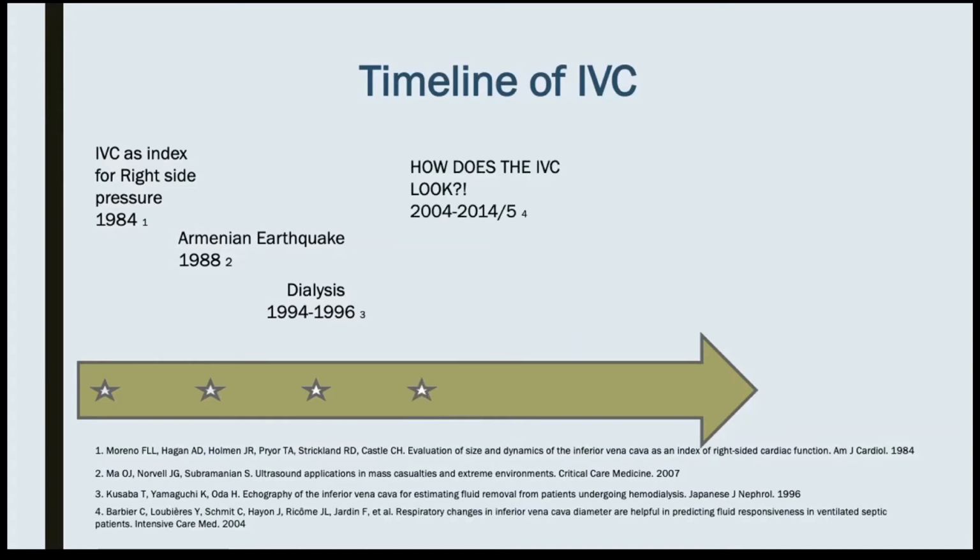And then came the paper in 2004 where someone said, listen, we're going to look at the respiratory changes of the IVC in septic patients, and does it correlate with our fluid management? And then everyone went, okay, this is it. For all the good reasons, this is where we are. And it became a mantra, and everyone was taught IVC.